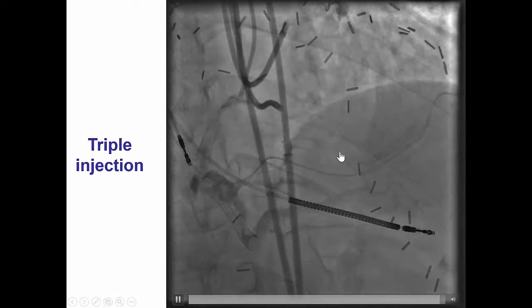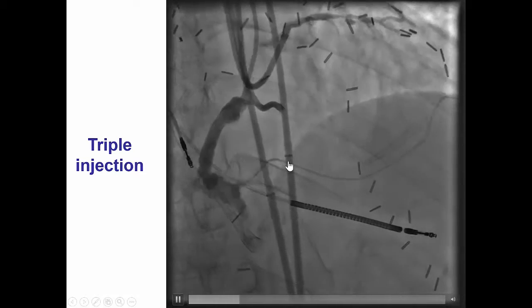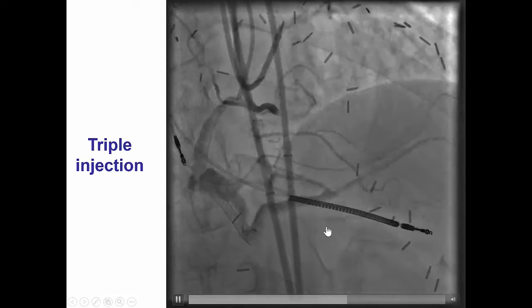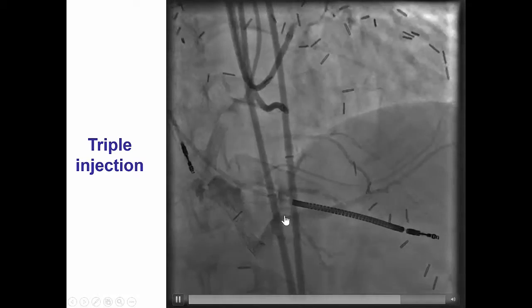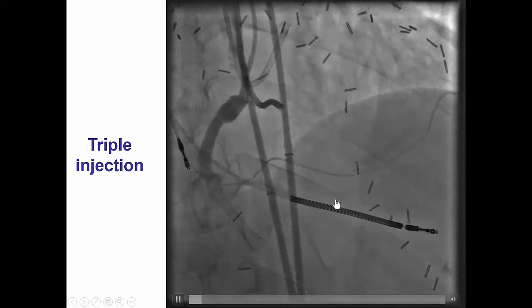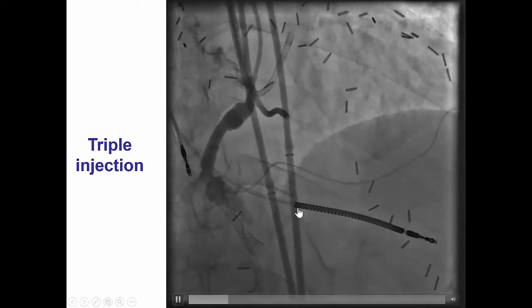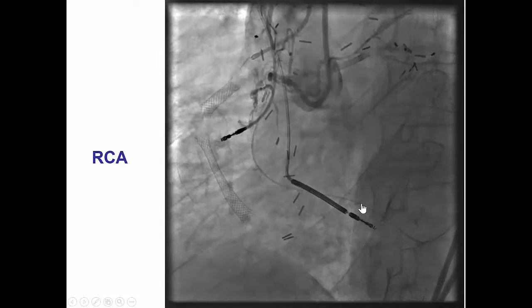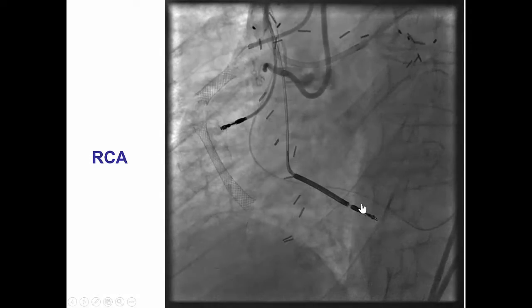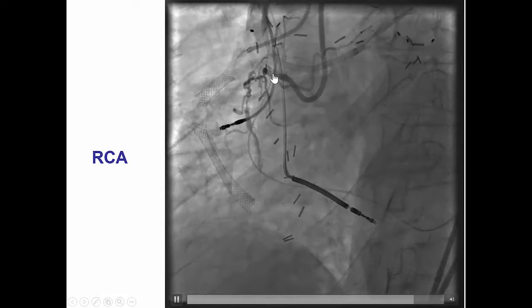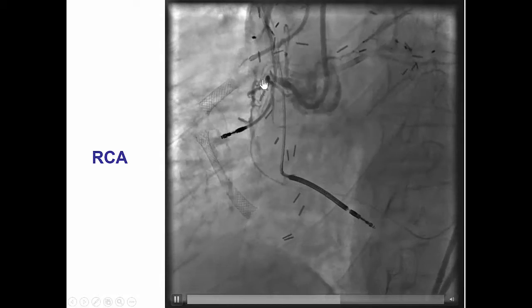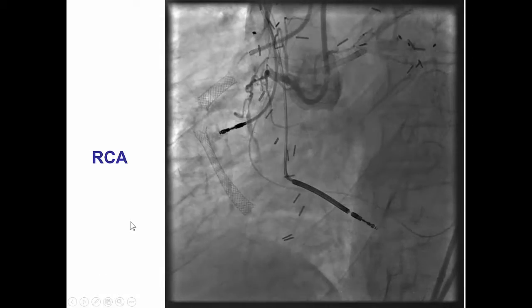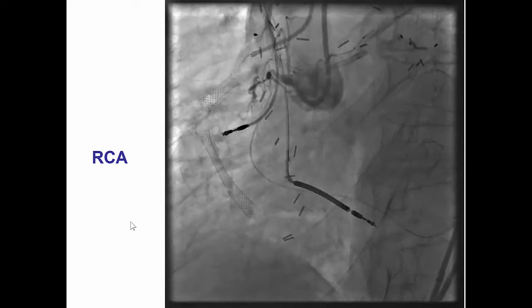However, even here we don't really have any good septal collaterals. There is filling of another smaller branch, but the posterior descending artery essentially fills only from the saphenous vein graft. Once again, the native right coronary artery has significant proximal cap ambiguity with multiple branches on both sides of the proximal cap, which was fairly difficult to discern.